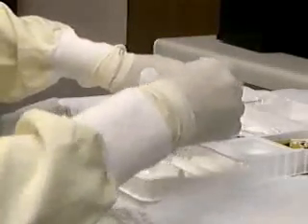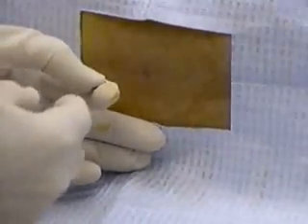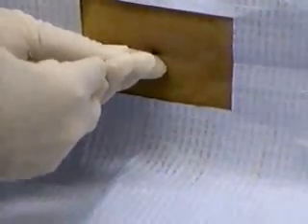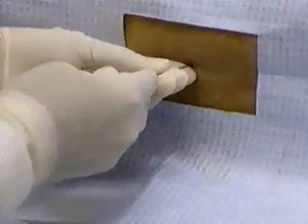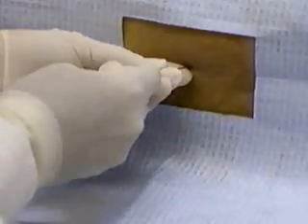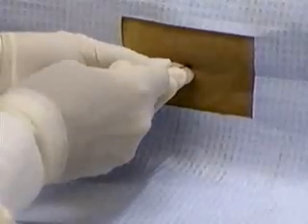While the anesthetic is taking effect, arrange your sterile specimen containers in sequence from one to four. Remember to unscrew the caps. With the bevel of the needle parallel to the long axis of the patient's back, insert the spinal needle at your chosen interspace. Use both hands to steady the needle. As you advance the needle, angle it toward the umbilicus. Periodically remove the stylet to check for fluid return. Whenever you change the position of the needle, replace the stylet. If you don't replace the stylet, you might catch a nerve root in the hollow needle.